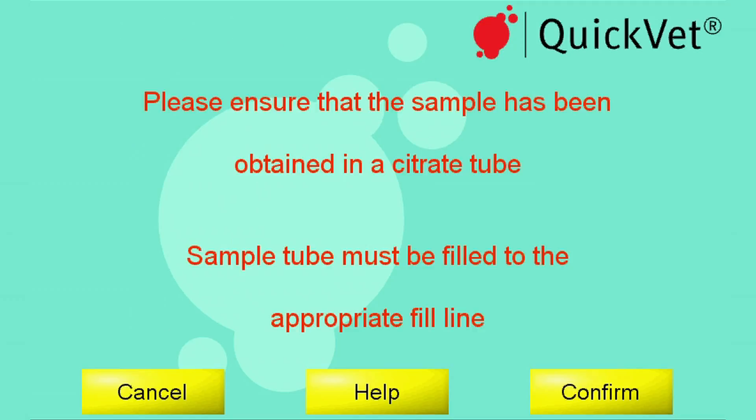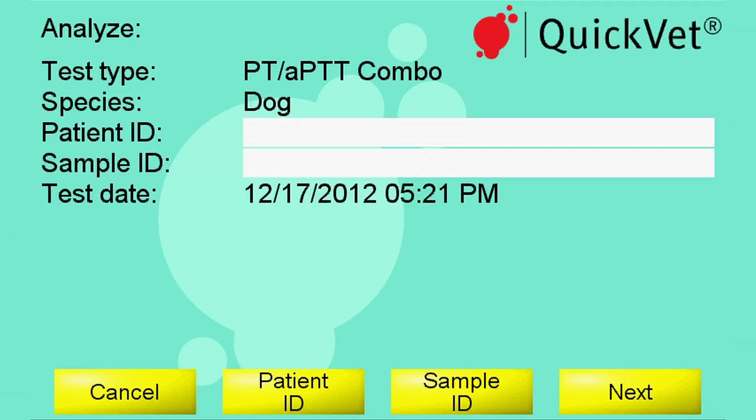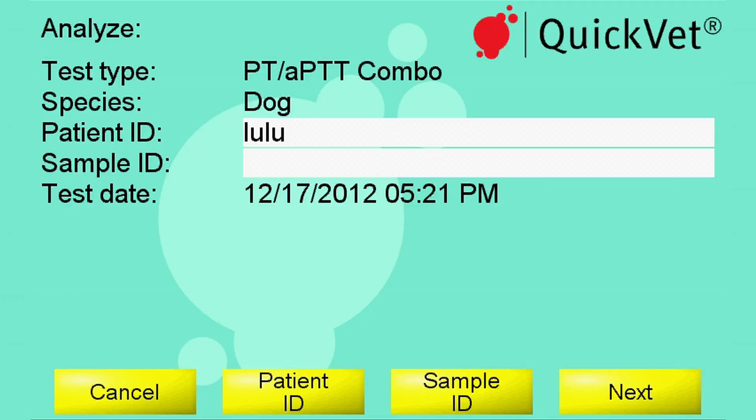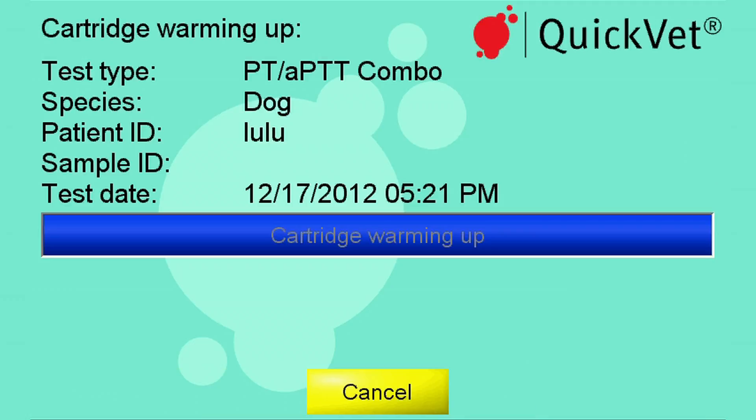Please confirm this by pressing the confirm button. You can add information about the patient by using the on-screen keyboard. You have the option to enter both patient name and sample ID.